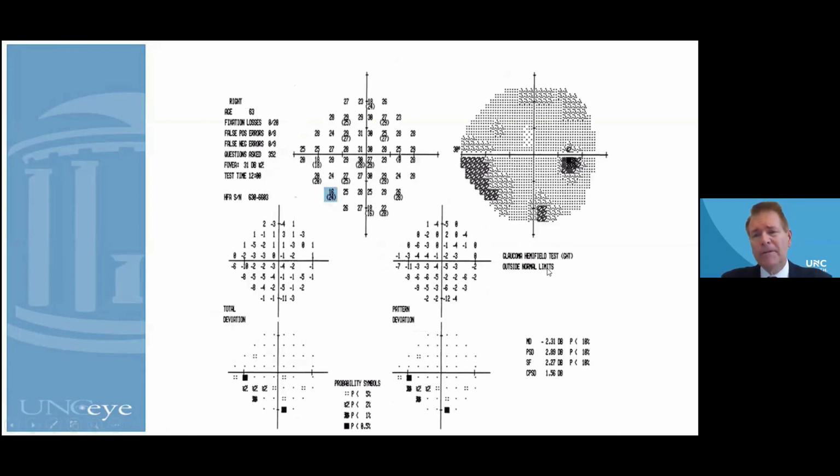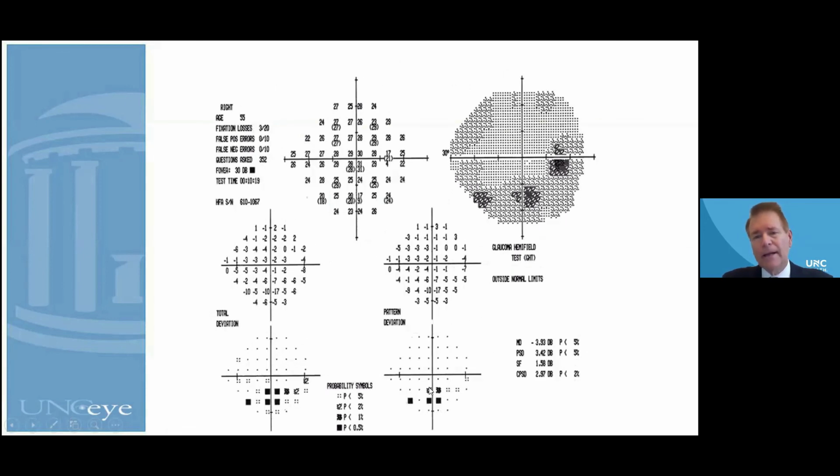Here's a glaucoma hemifield test that's abnormal by this inferior arcuate defect that breaks into a nasal step. Notice the PSD is still not at less than 5%, so this is a little more sensitive than PSD. And another early paracentral defect in one of those regions compared to the opposite hemifield that's statistically abnormal and shows up on the glaucoma hemifield test as such.